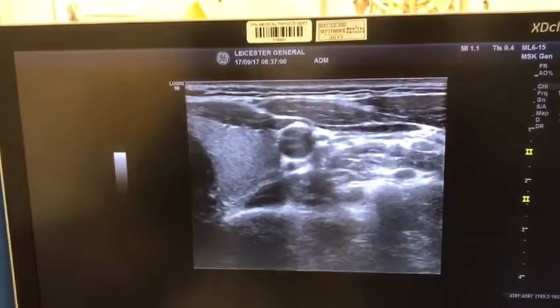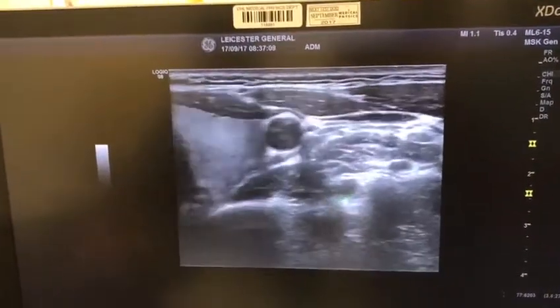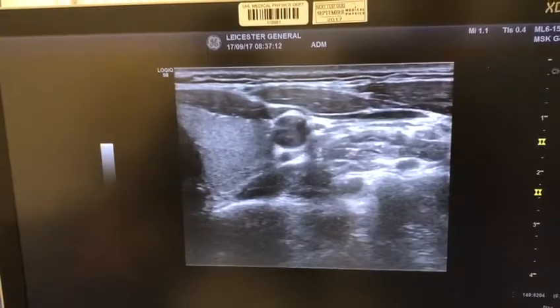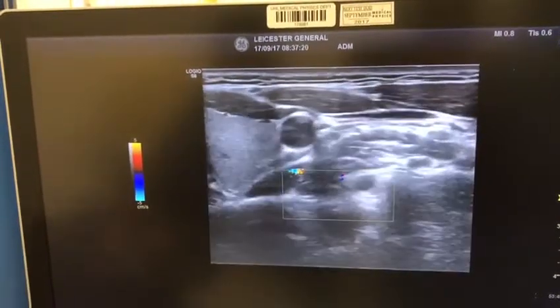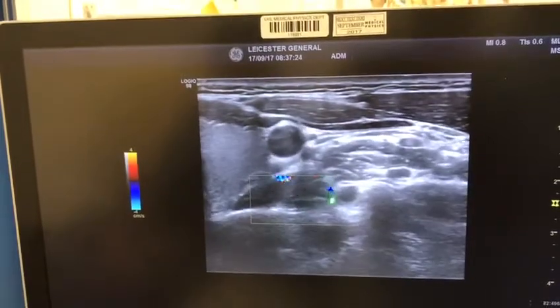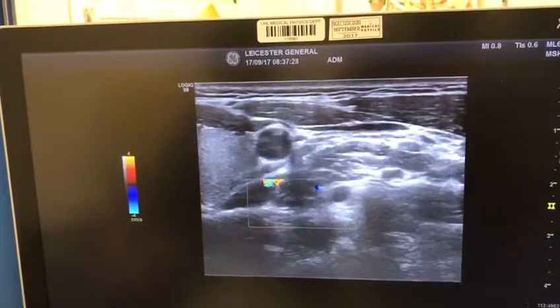Once you find the C7 level, another way to confirm it is by applying color Doppler to look for the vertebral artery. As you can see, you're picking up a signal here — that's your vertebral artery, and that's your C7 nerve root.